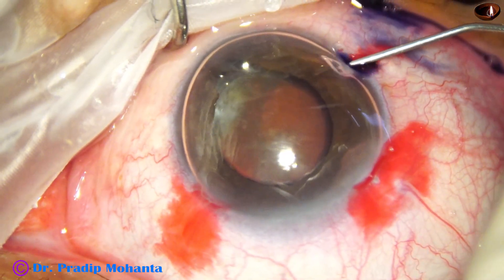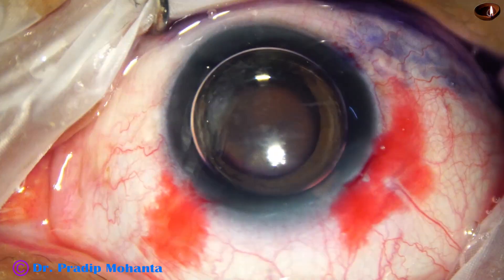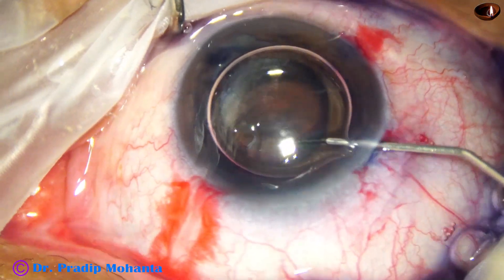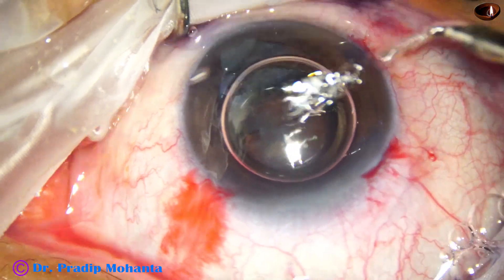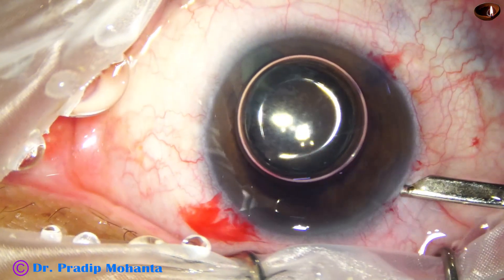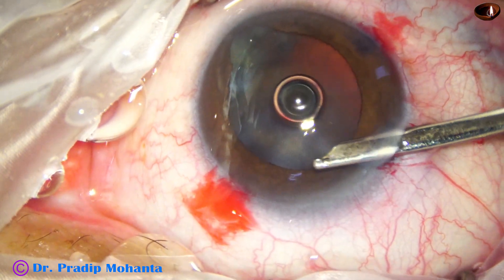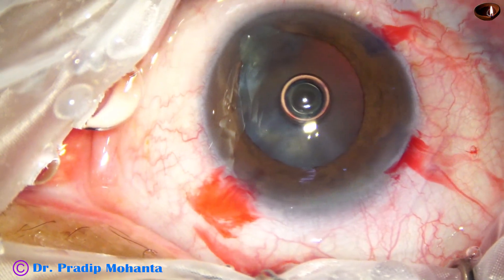The anterior capsule is being stained with trypan blue dye after injecting an air bubble in the anterior chamber. This is adrenalin and phenocaine. Phenocaine contains tropicamide, lignocaine, and phenylephrine. The dilatation of the pupil is okay, and if this dilatation is maintained during emulsification of the nuclear pieces, we will not require any pupil expansion device.